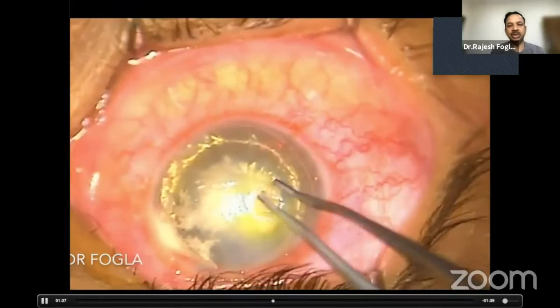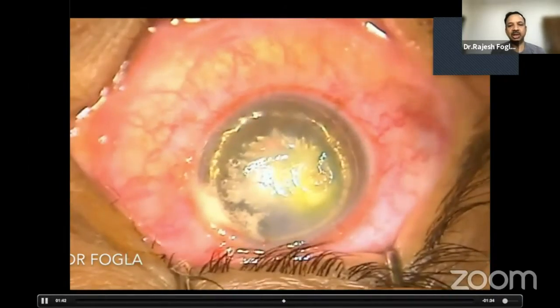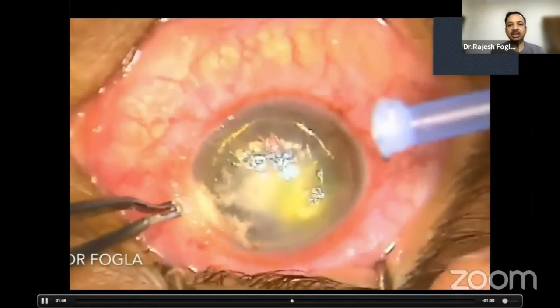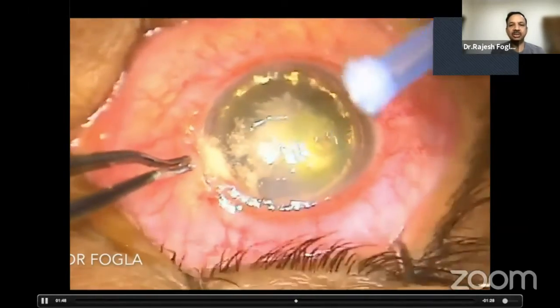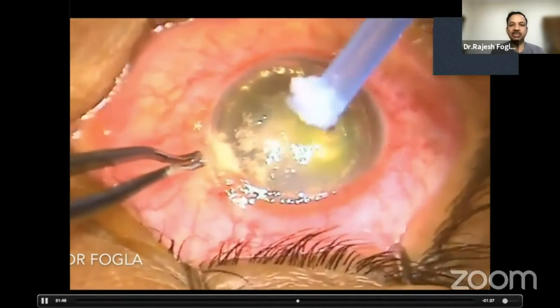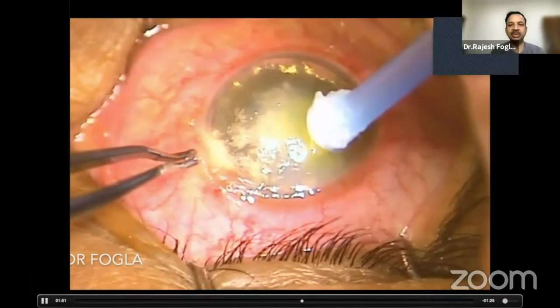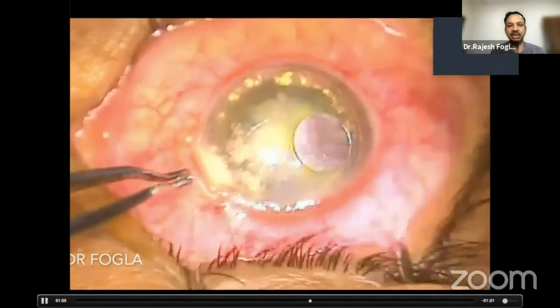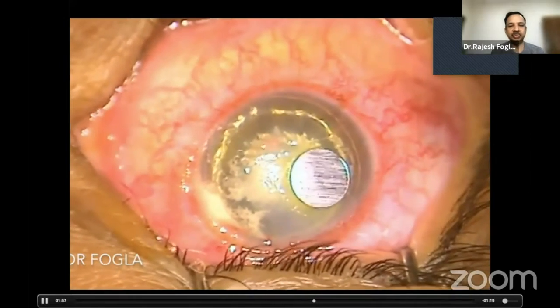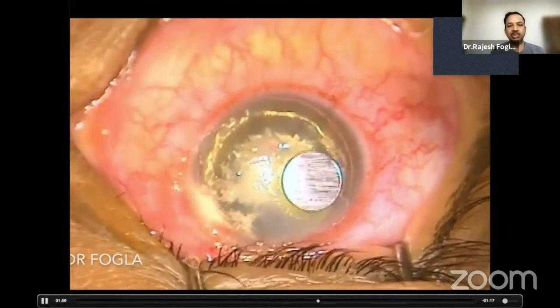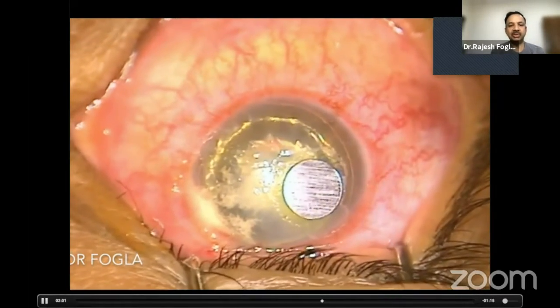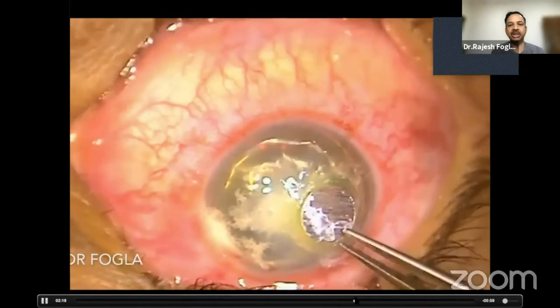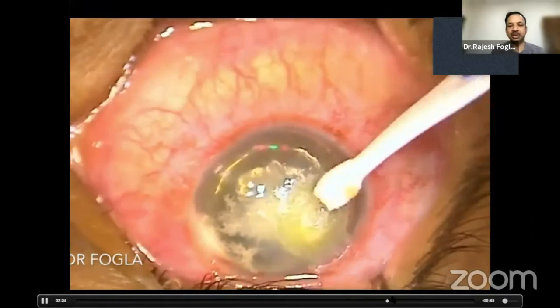For the application of glue, you can see we are removing all the loose epithelium and the debris. The glue is applied on a small circular disc, which can be refined with a two millimeter punch. Then you can apply that disc onto the cornea, which ensures that your anterior surface is pretty smooth. Although the glue can be applied directly, that tends to leave a slightly irregular surface. Then you can either leave that disc behind or remove it and then place a bandage contact lens.